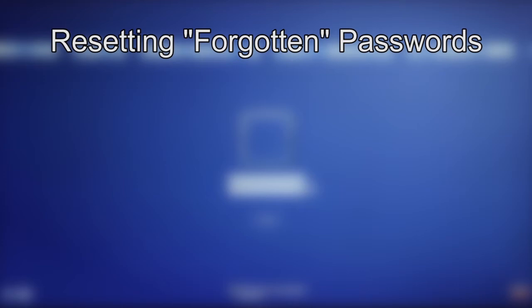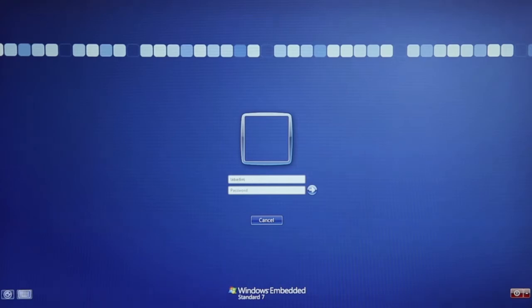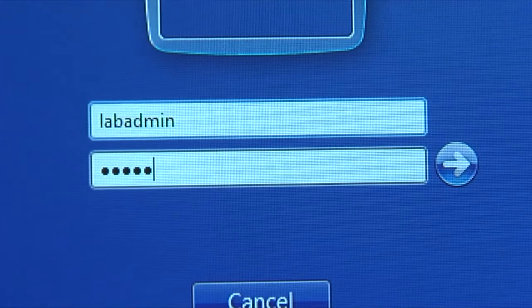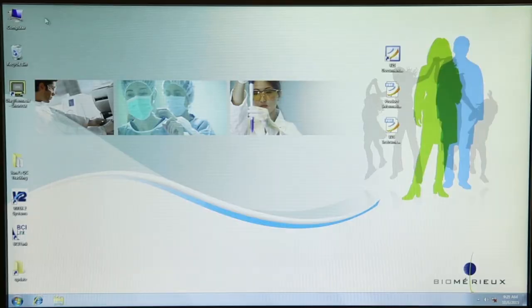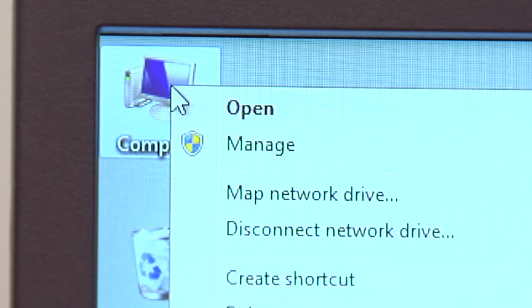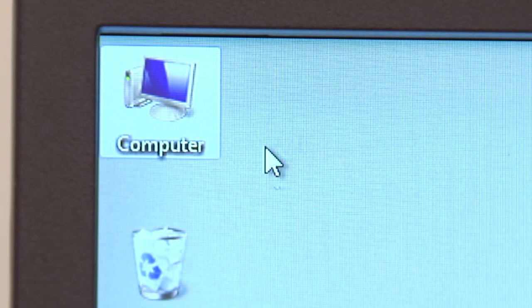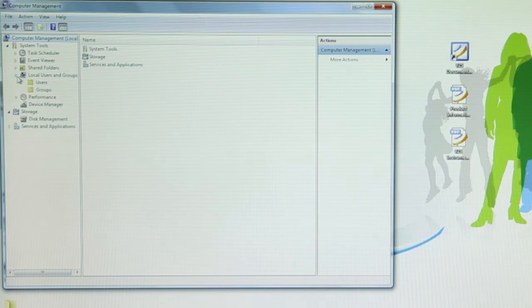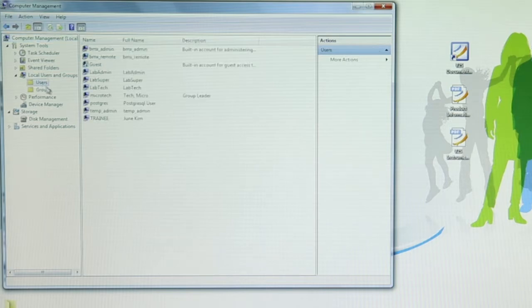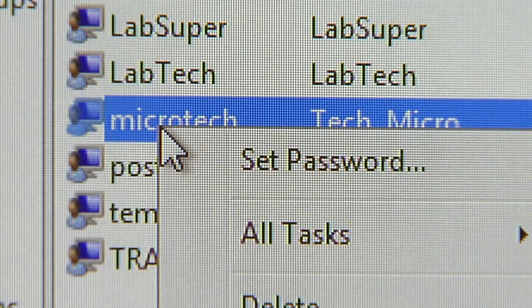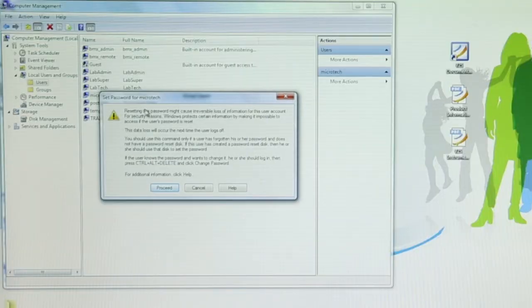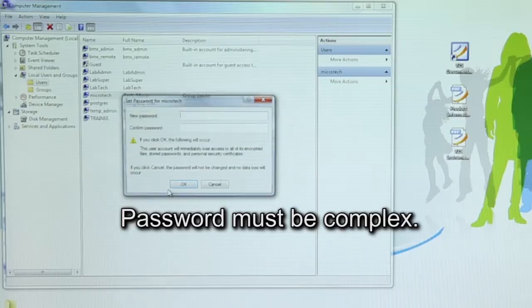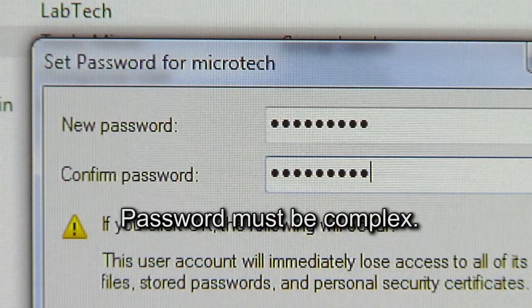Resetting Forgotten Passwords. Use this procedure if a user cannot remember their password. Forgotten passwords cannot be retrieved; instead, a new password is assigned to the user. Log into Windows 7 with the user name and password with administrator privileges. Right-click on the Computer icon — this icon can usually be found in the upper left corner of the screen. Click on Manage to open the Computer Management window. In the navigation tree under System Tools, click the arrow symbol to the left of the Local Users and Groups folder to open it. Click on Users. Right-click on the forgetful user — Microtech. Click on Set Password. A Set Password warning window displays; click Proceed. Enter the new password and re-enter it to confirm. Click OK.